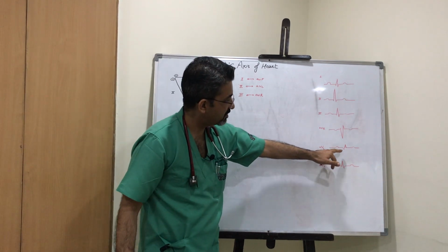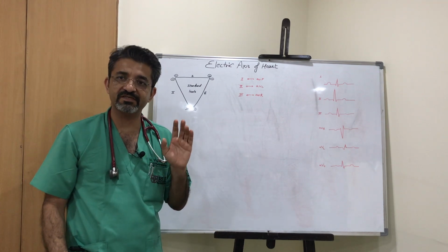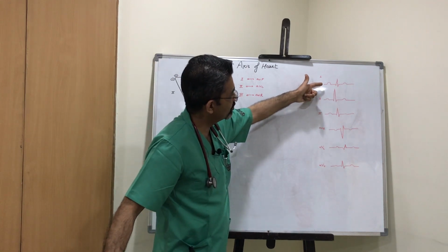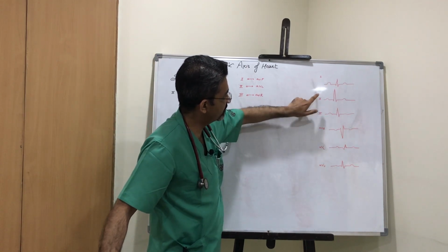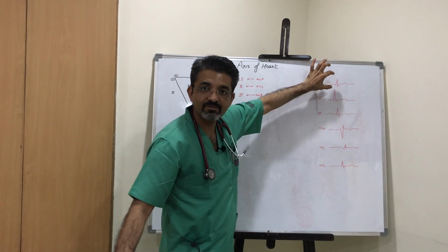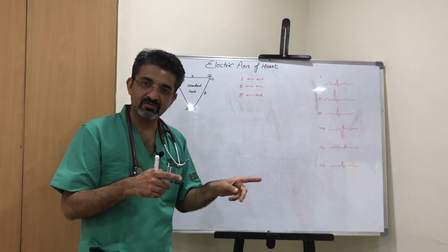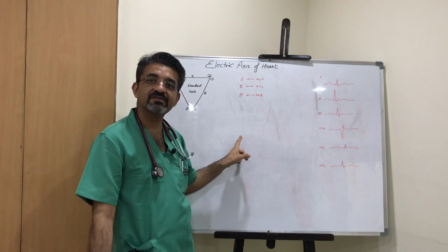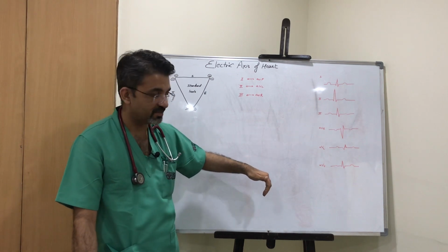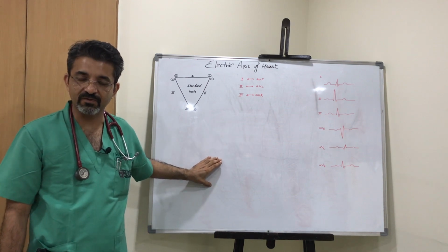If I don't have an equiphasic component, then I find a lead which is showing somewhat equiphasicness and I plot a graph. Thirdly, I can directly go to my independent leads, 1 aVF, 2 aVL or 3 aVR. I find a sum total of positive and negative, and I plot the graph and find my axis. I know whether my axis is northwest axis, left axis or right axis, right? I know the causes of left axis deviation now and right axis deviation now.